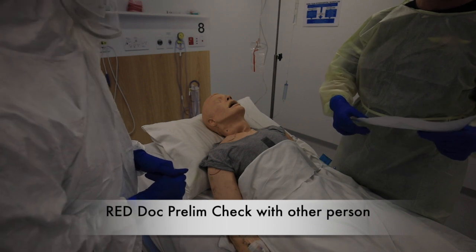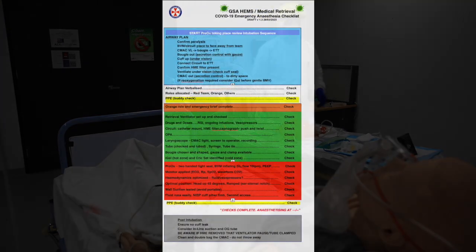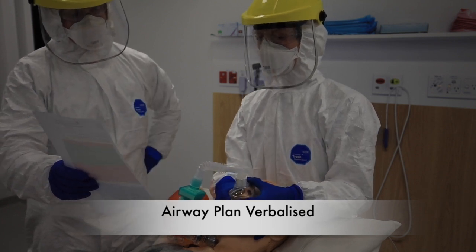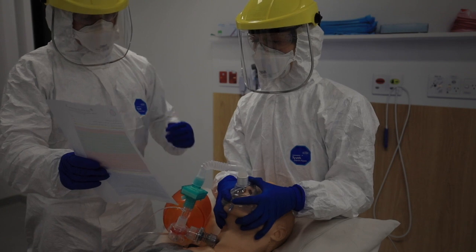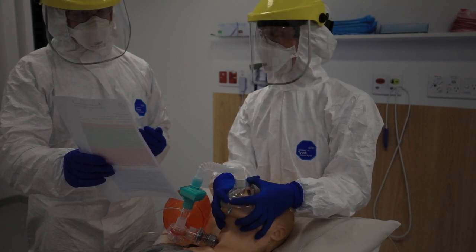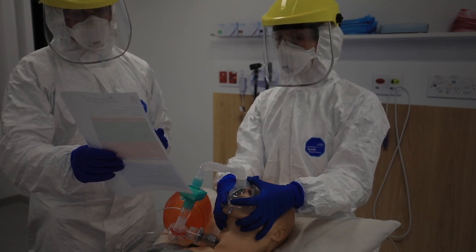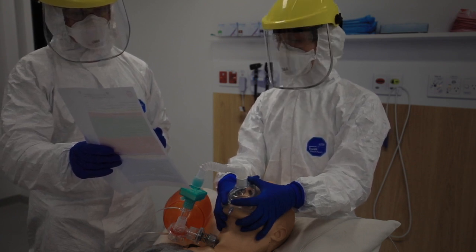In preparation for our RSI — monitoring confirmed. Let's read through the intubation sequence, which will capture our airway plan. We're going to confirm paralysis — make sure the jaw's floppy and end-tidal CO2 has stopped. Then put the bag valve mask and circuit down and away from the patient. Using the C-Mac as video laryngoscopy. Can you angle the screen for me? Then bougie, then ET tube just like normal, keeping under vision.